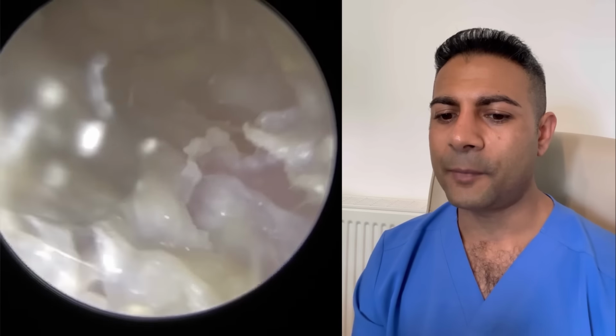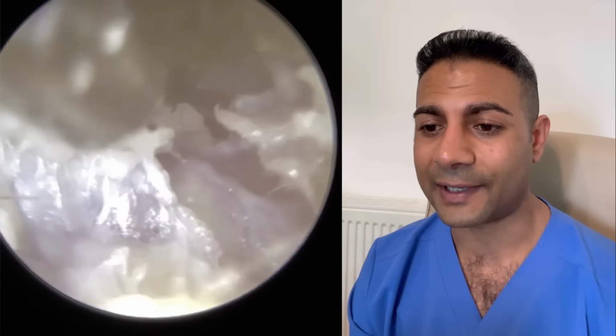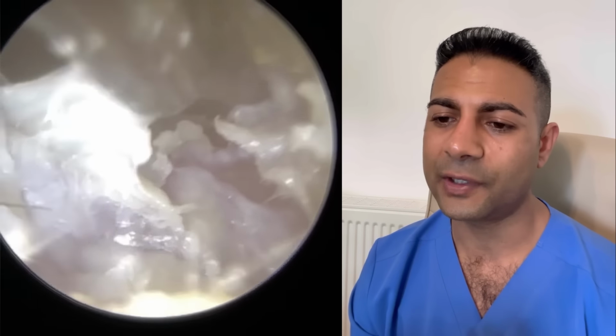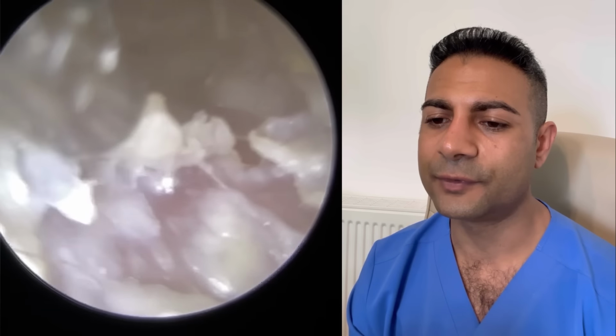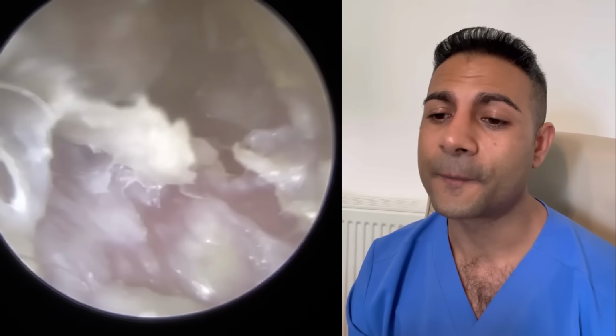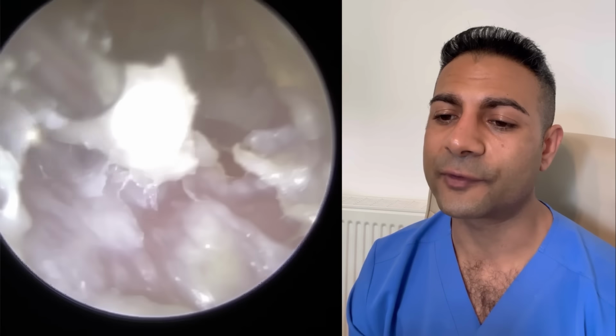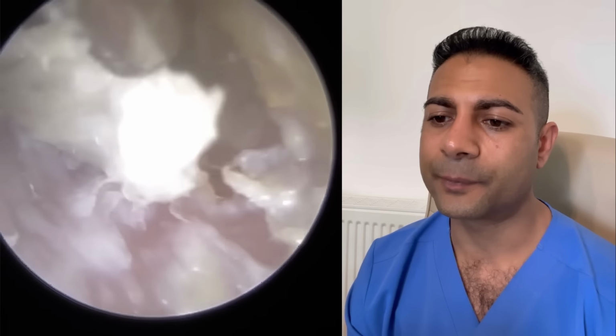And remember, the ear canal itself is only 2.6 centimeters on average in an adult in length. So the eardrum is not too far away. So you do got to be really, really cautious and just resist the urge of poking inside your ears. And there are medications that can help.